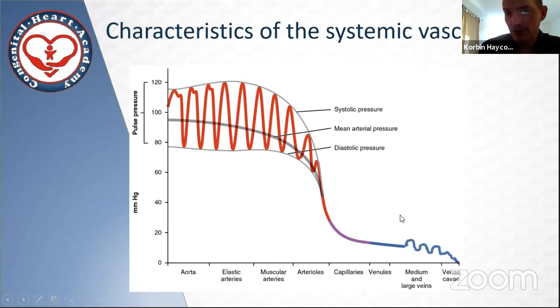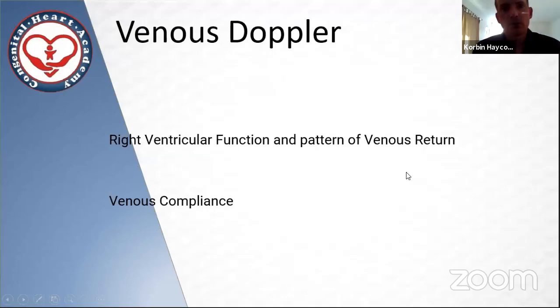But when we get more venous congestion and the pressures start to rise, we start to stretch out these smaller vessels. And when they start to get to the limit of their capacitance, then that venous pulse gets transmitted back farther, deeper and deeper into the parenchyma, and we can actually measure this, and it correlates with venous congestion of the organs. So with the venous Doppler, I think most people are not really too familiar with it.